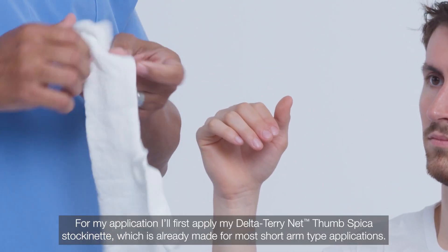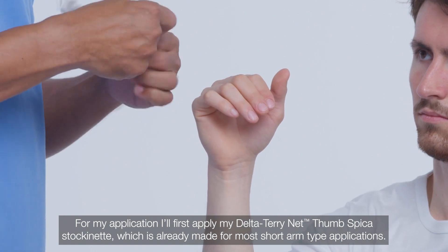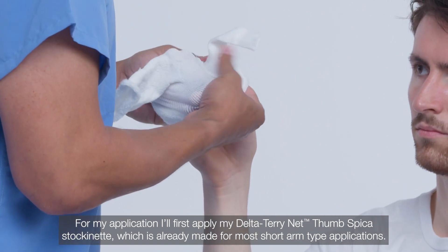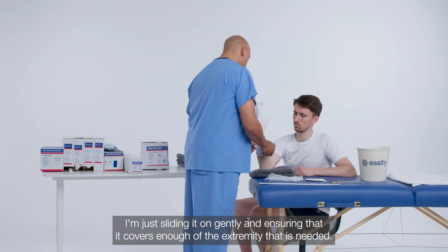For my application, I'll first apply my Delta Teri Net Thumb Spica Stockinette, which is already made for most short arm type applications. I'm just sliding it on gently and ensuring that it covers enough of the extremity that is needed.